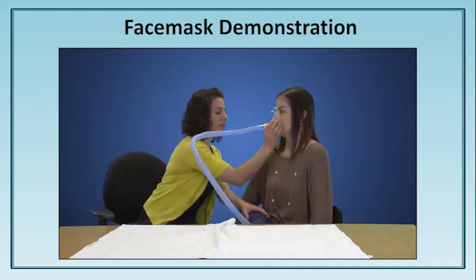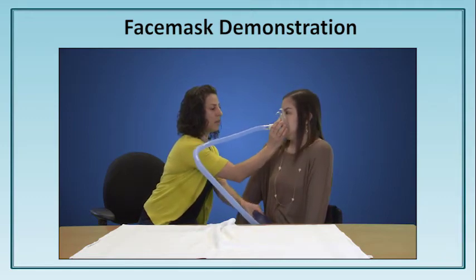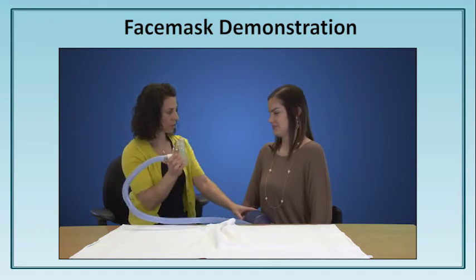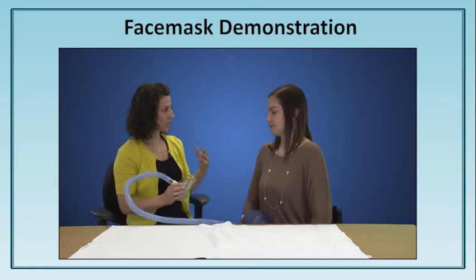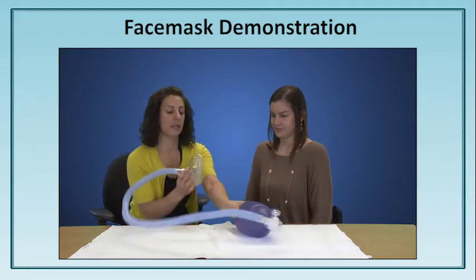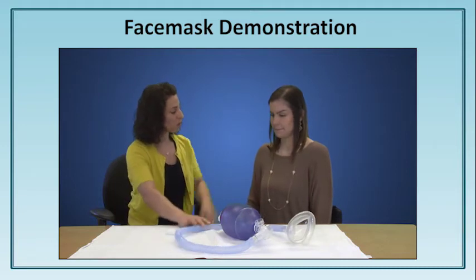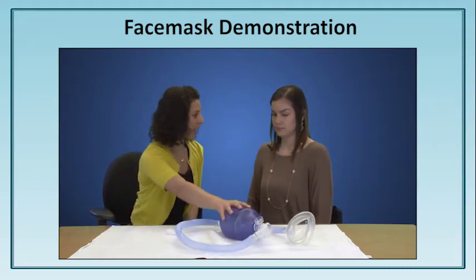A little bit of pressure on your face — breathe in, breathe in, breathe in, breathe in. Good. How did that feel? Good. Did it feel similar to the mouthpiece? Did you feel your chest rise? We did about three or four compressions. Yes. The idea behind this, with the mask or the mouthpiece, is that you can cause full chest rise with the bag.